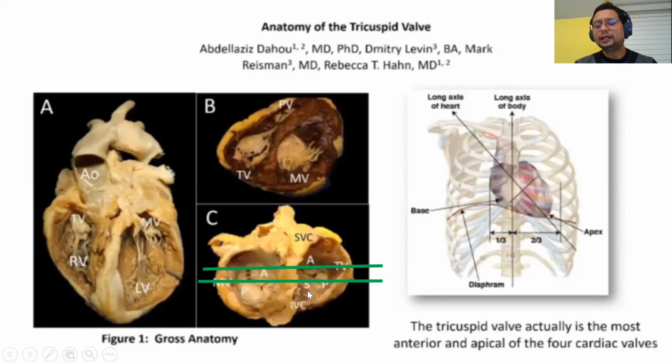So, coronary sinus means posterior leaflet, aorta means anterior leaflet. We also have this cut here, our long axis view. We have the anterior leaflet of the mitral valve and the posterior leaflet of the mitral valve, transecting the aorta. You can see the aorta here, and we can measure the aortic dimension there as well. From the left atrial appendage to this side here, this is what we call a bicommissural view.